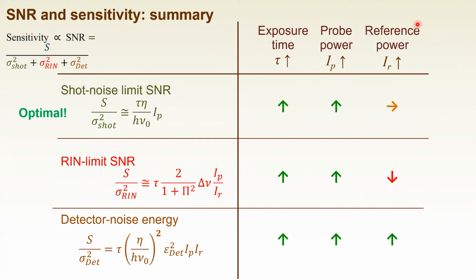It's 1 point. And then what is going to happen if you increase the probe power? Okay, it increases the SNR again for all of the cases. So using more probe power is in most cases good.